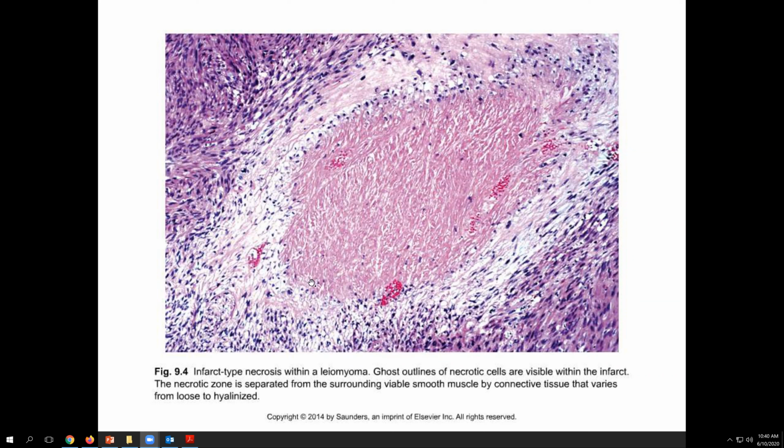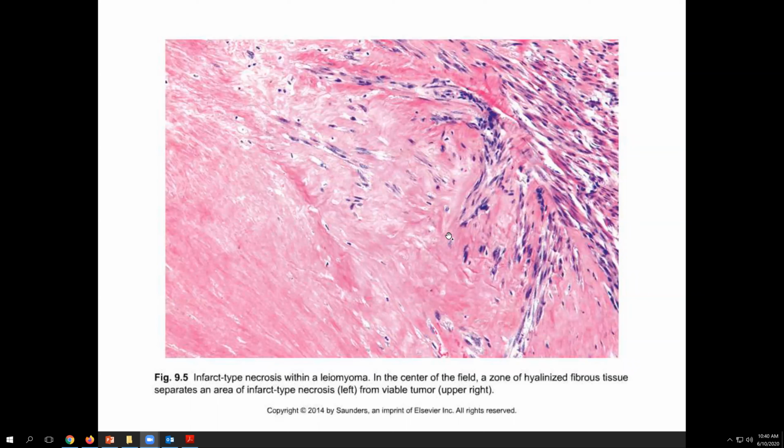As you see, sort of an infarct-type necrosis, a geographic zone with the surrounding peripheral edematous zone of cells, as opposed to tumoral necrosis, where usually the tumors are right up against the area of necrosis. Here there tends to be a reactive zone, and it's this zone where we can see mitotic figures. Another example of a very more common change, a hyaline fibrosis that can be seen in these tumors, but that can also lead to areas of necrosis, as we see sort of hyaline necrosis here on the far left of this tumor.